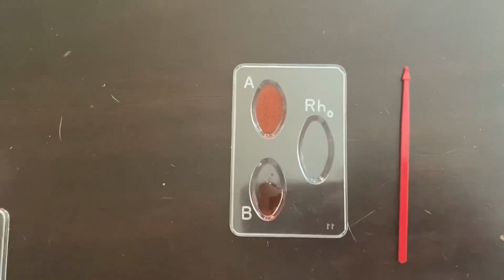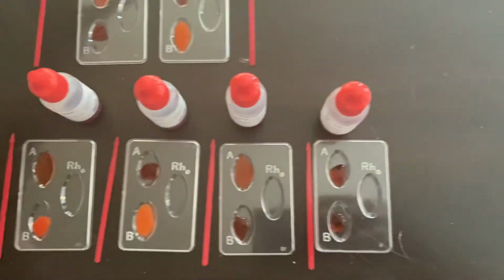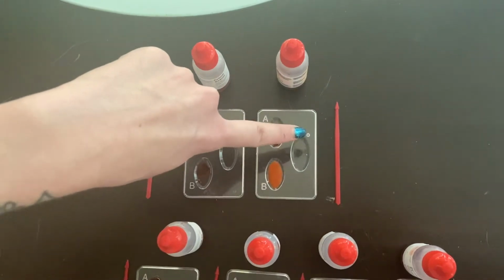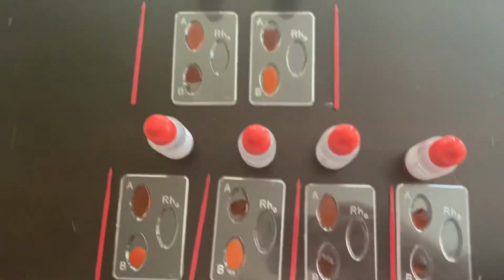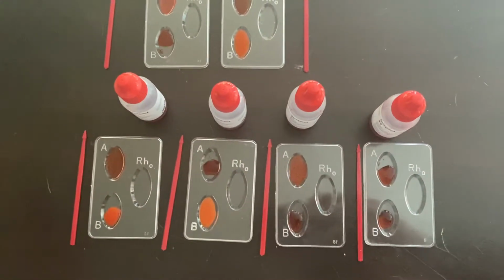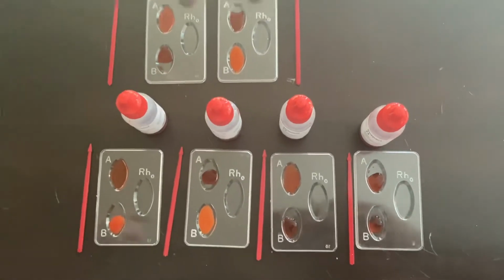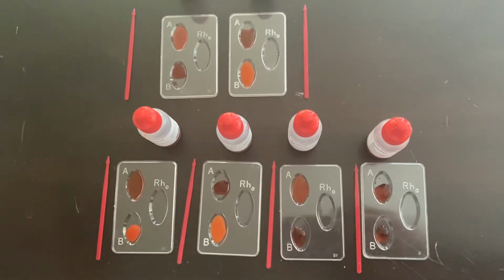So I'm going to give you a little scenario where we would use this. Over here we have a sample from a crime scene, right here. We have the victim's blood. Okay, so this is the victim. This is the unknown person who is at the crime scene. And we have 4 possible suspects. What we want to do is, can we rule anybody out, right? It doesn't necessarily prove anything, but if you are a suspect and you have the same blood type as the crime scene, it is evidence for further investigation.